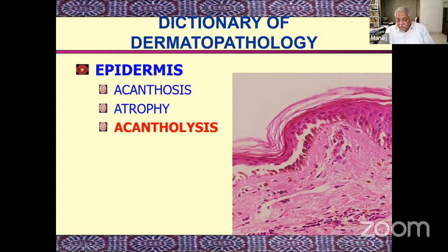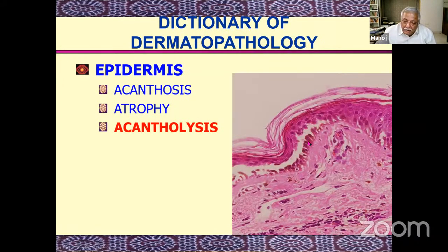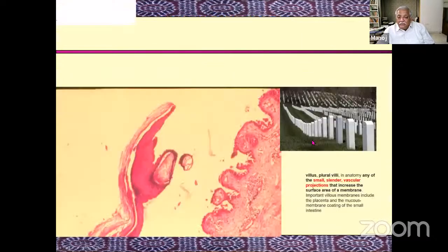This is a condition known as pemphigus. It's an antibody-mediated disease, and it has a very characteristic appearance. As you can make out here, the individual cells lose their attachment to each other, the desmosomal attachment. So adjoining cells of the basal layer may be separate from each other, right? However, they will remain attached at the basement membrane because that junction is not compromised. So you have individual cells standing in rows, a row of tombstones. They are attached at the lower part, separated in the rest of the thing. So this row of tombstones is a characteristic appearance of this.